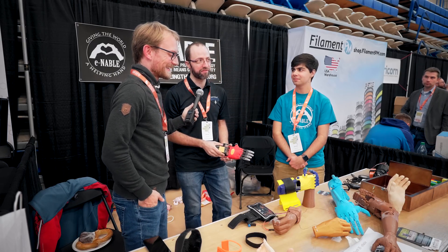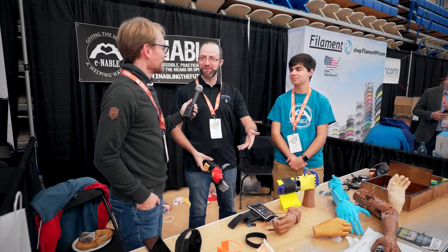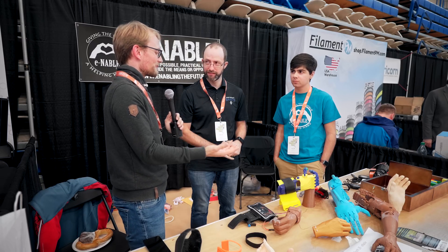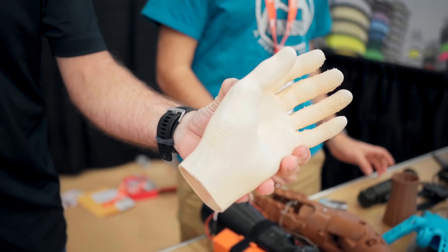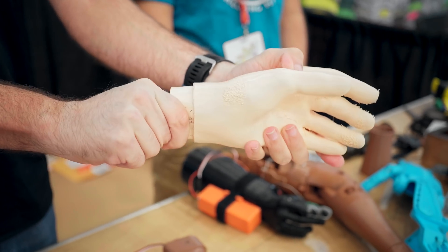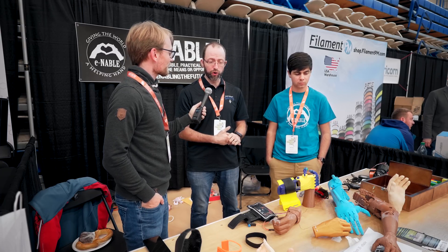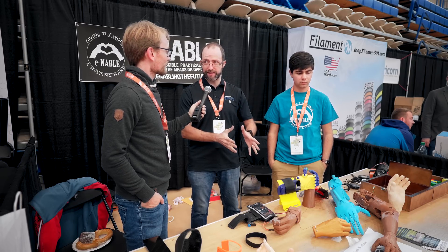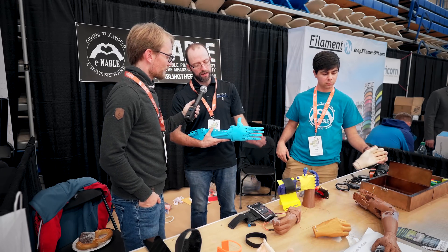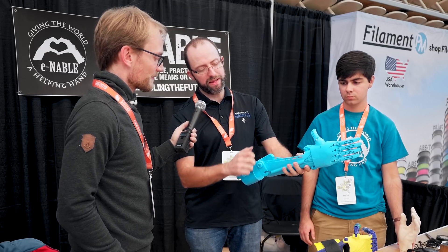That one has disappeared — actually, the founder of Enable was here and he said he needs it for another conference. So when the founder says I need that, you give it to him. And it looks like some of the prostheses you have here are adaptable to any limb difference shape. But what you're also doing in the Enable project is creating custom fits for people. For custom fits, if somebody sends us photographs and there's a ruler within the photograph, we can actually do custom scaling and figure out the exact size that we need. So this is an arm with the same hand design — maybe they're missing their arm somewhere on the forearm — and as long as they can bend their elbow, we can get them one of these.